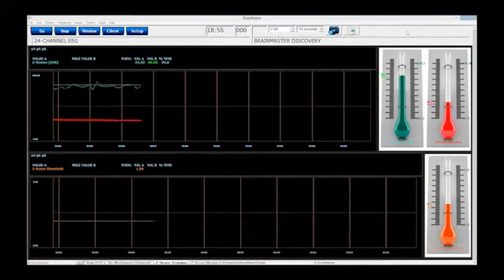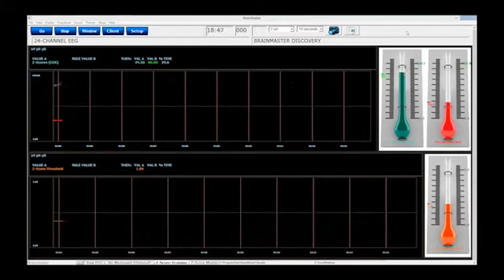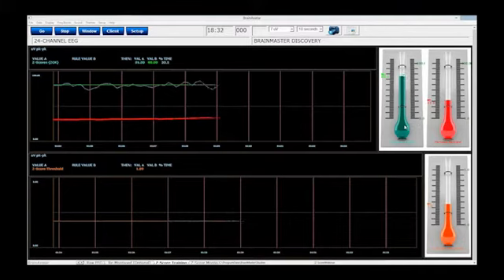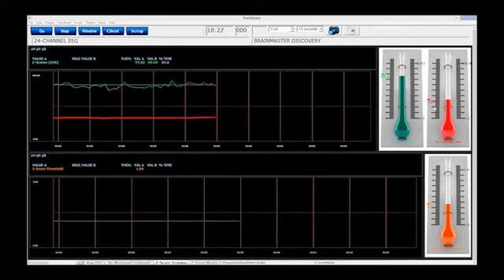The reward sounds are going to happen with it. If you're using a multimedia player or a DVD, you're going to be able to have that as feedback. Or if you're using the BMR Flash player, that's also going to be rewarded whenever this turquoise line goes above the green line. You're also going to notice this red line right here. This red line is basically the percent success of the ZScore training. So how often it's actually successful, the turquoise line being above the green, is how this is going to be moving. And as you can see right now by this thermometer, we're at about 34%.